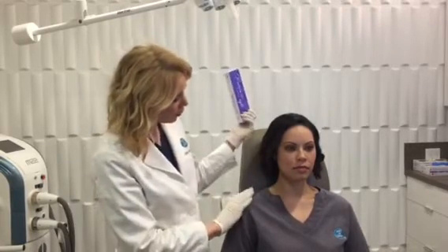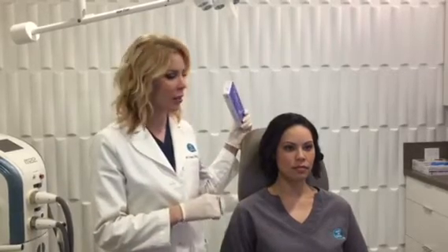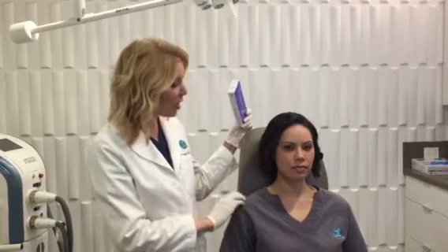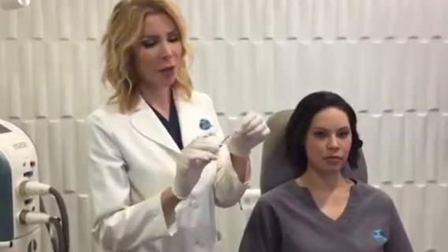So we're going to show on this beautiful patient just a little bit of subtle enhancement. She looks fantastic. She's had this product in the past. But she's a new mom and we haven't done anything in quite some time, so we're going to focus in on her. So it comes as a clear gel. It's 1 cc or 1 ml in volume, and it just has really nice lifting power.